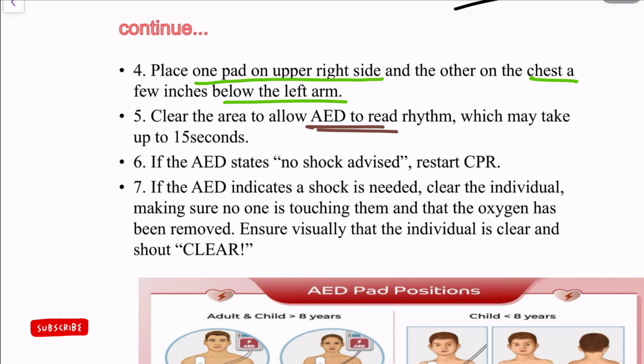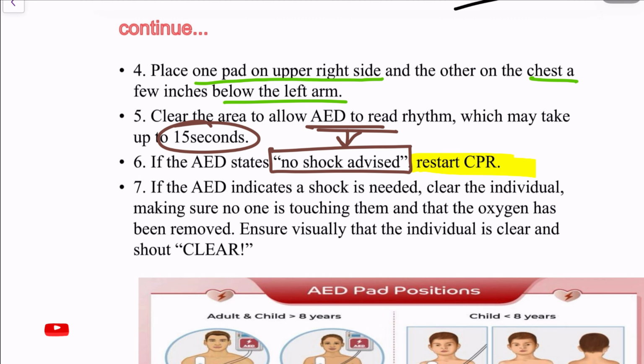After attaching the pads, you have to wait for approximately 15 seconds for the AED machine to detect whether the rhythm is shockable or not. If no shock is advised, suppose the AED machine says the rhythm is not shockable, then shock should not be given, and you restart the CPR immediately.